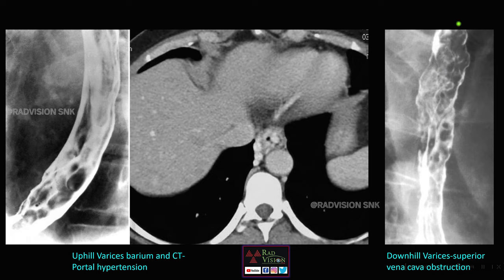Downhill varices flow in the cephalad-to-caudal direction and are usually seen in the upper or middle esophagus, typically caused by superior vena cava obstruction — such as SVC obstruction from mediastinal tumors or other causes. So remember: uphill varices in portal hypertension, whereas downhill varices in superior vena cava obstruction.